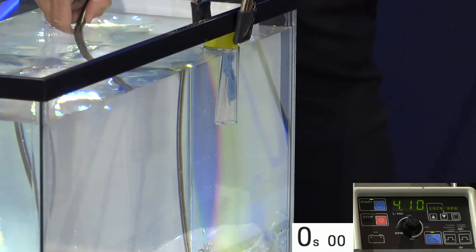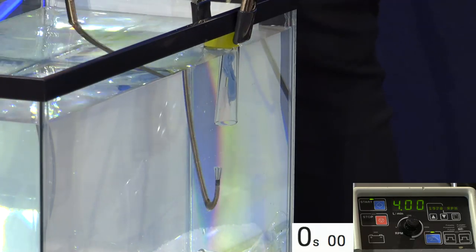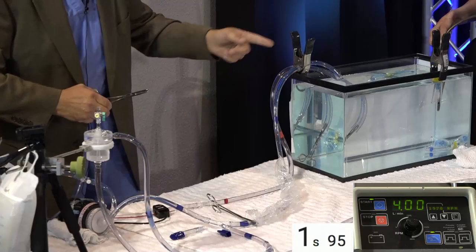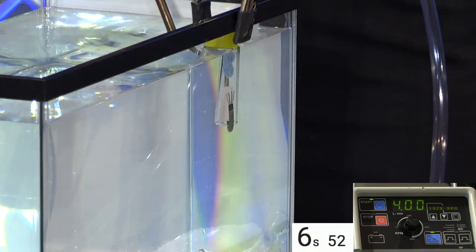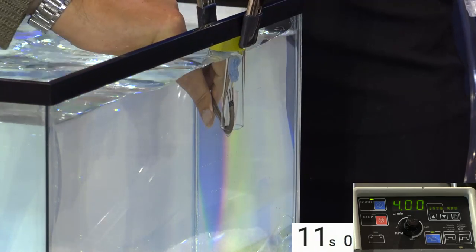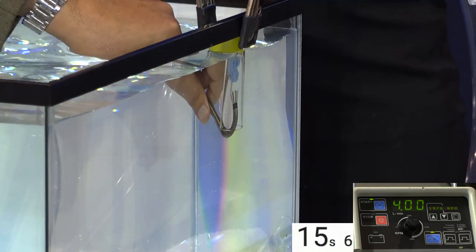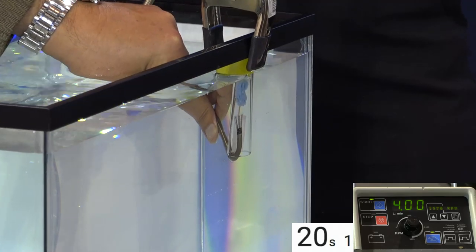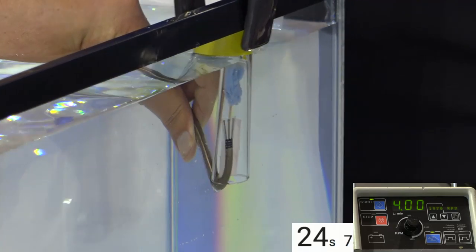And remember, don't put your hand down in the water. Do it like you're in real life, from a more acute angle. There you go, like that. Go up and get the whole thing. You know what? That's got the toothpick on it, so it's not going to go. Take some bend out of the catheter. Pull back. You'll have to loosen the blue tubing. Pull back just a little bit.